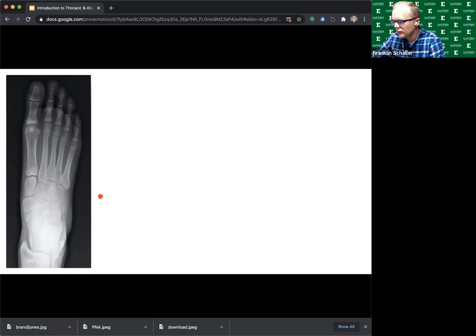And this one is sort of tough to see, but there are several metatarsal fractures. 2, 3, and 4 are all fractured. So let me see if I can point with my cursor. Fracture here, 2, 3, and 4. It's subtle. I wish I could zoom in on it more to show you guys. But given the history of getting run over by a car, foot ecchymosis, tenderness, we're not surprised here. This patient is going to need splinting and follow up with ortho at a minimum, right?